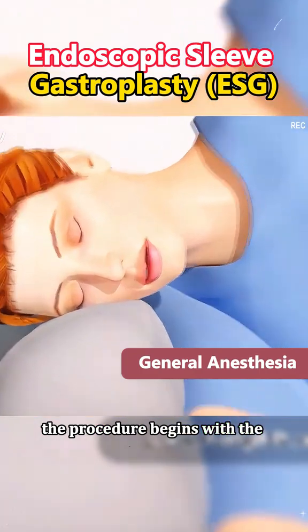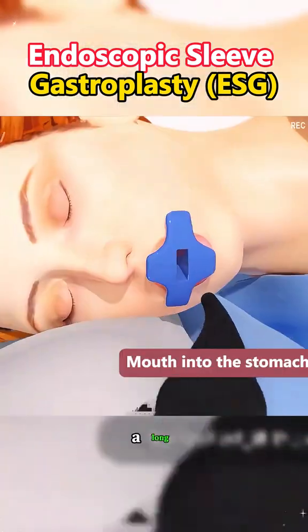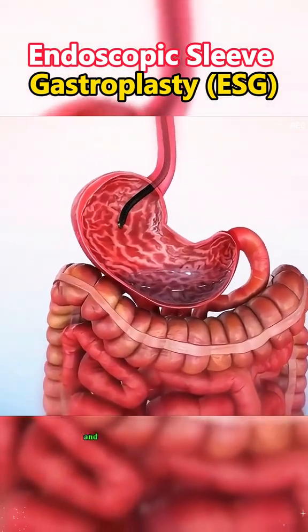The procedure begins with the patient under general anesthesia for comfort. The surgeon uses an endoscope — a long, flexible tube with a camera — and specialized tools, which is inserted through the mouth and into the stomach.